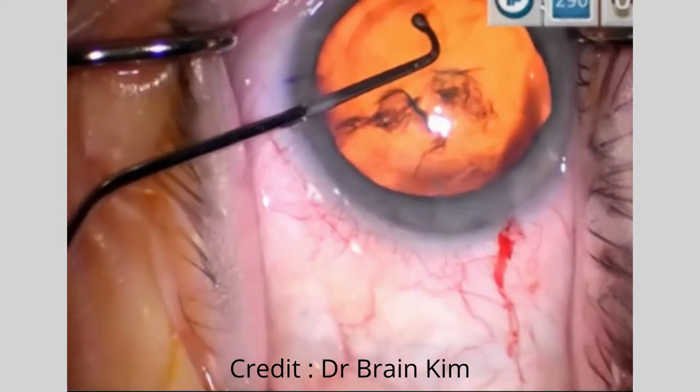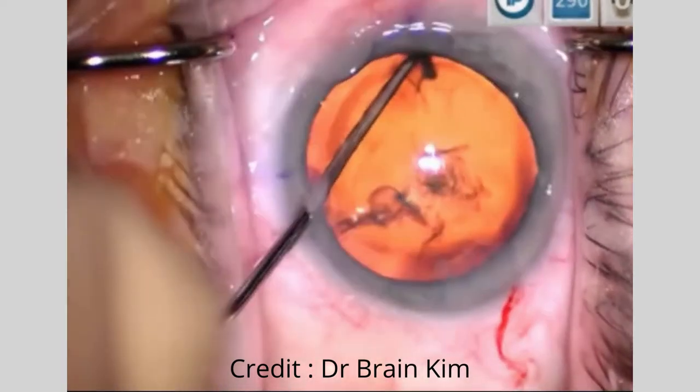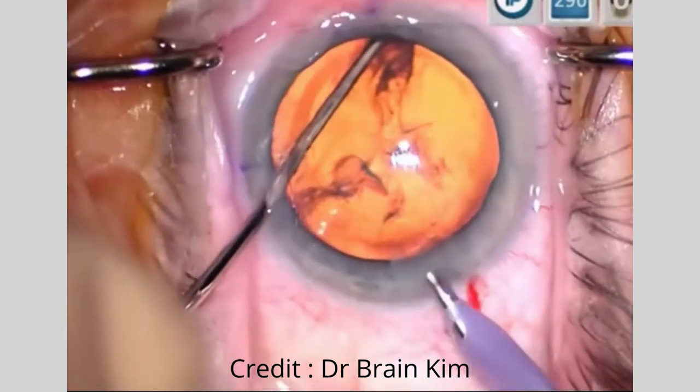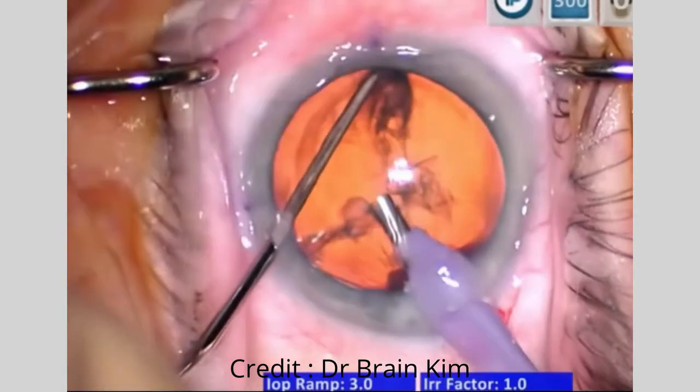I'm sliding the chopper in the pronated position down into the epinuclear material underneath the anterior capsule, rotating my hand so that it's supinated now. This is the ready position for the chop maneuver. Just for illustration — going back out pronated, and then supinated back into the equator, and I'm in the ready position to initiate the chop.